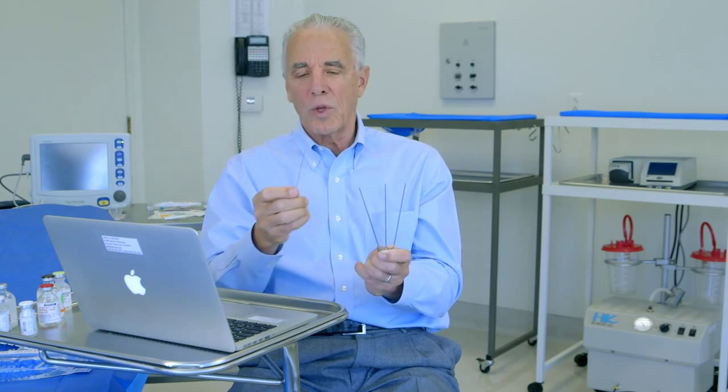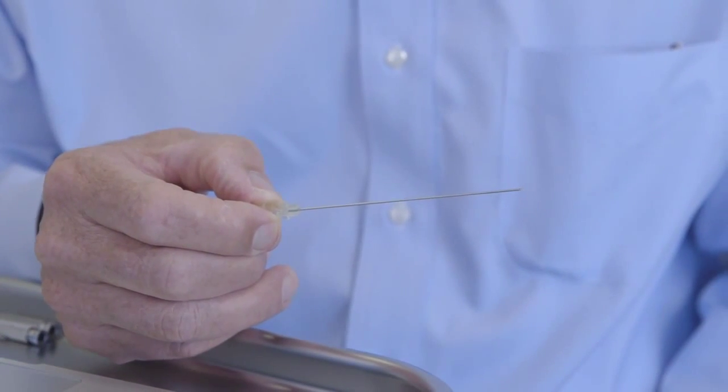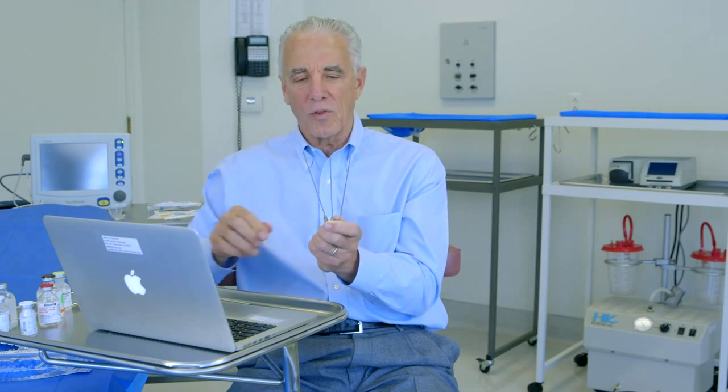Our typical pattern for infiltration is we do a little bit of infiltration using a spinal needle. This is a 20-gauge spinal needle. So we will initiate the tumescent infiltration with a 20-gauge spinal needle just a little bit under the skin, in the superficial fat and mid-level fat. Just enough to subsequently allow these blunt-tip cannulas to be placed with minimal discomfort. We don't use very much volume with this, but just enough to make the rest of the infiltration comfortable.